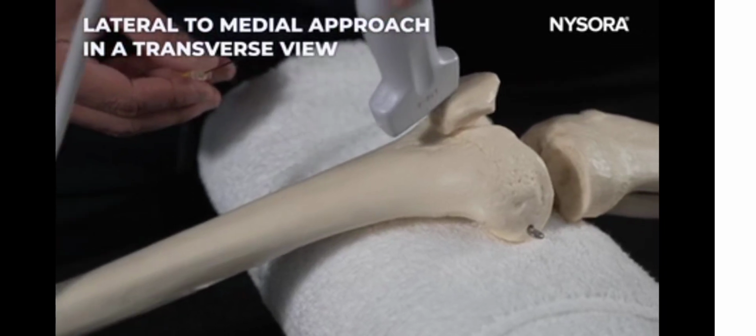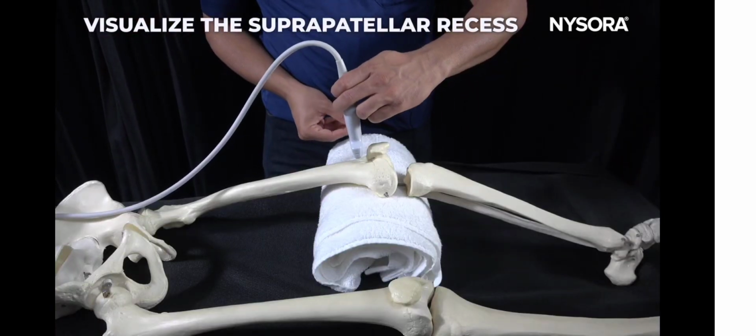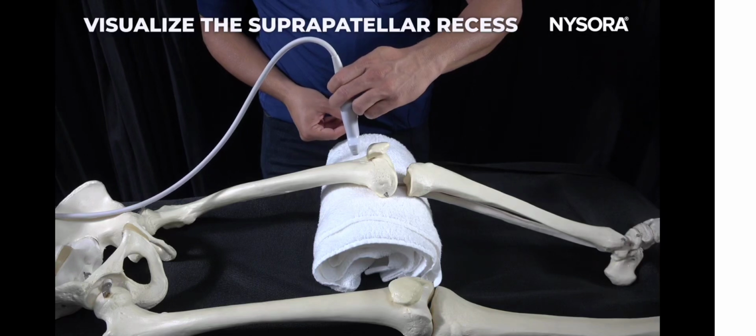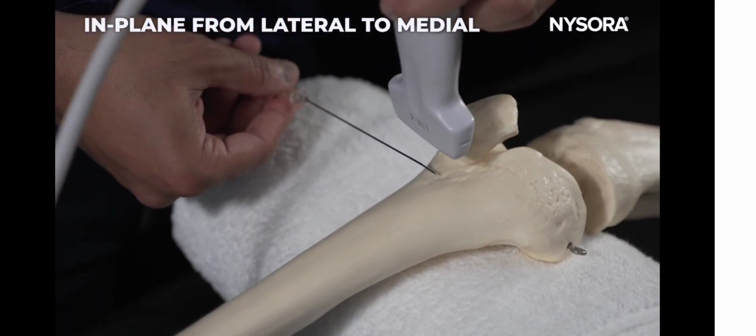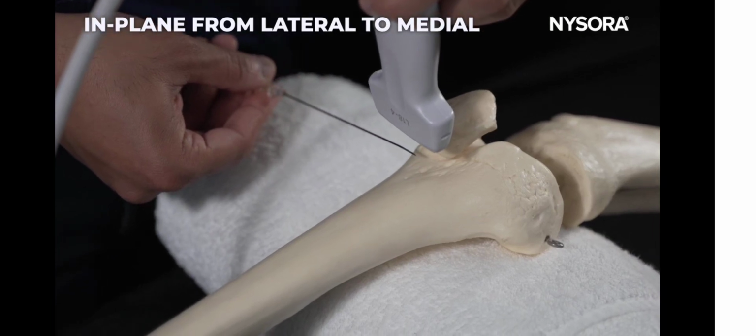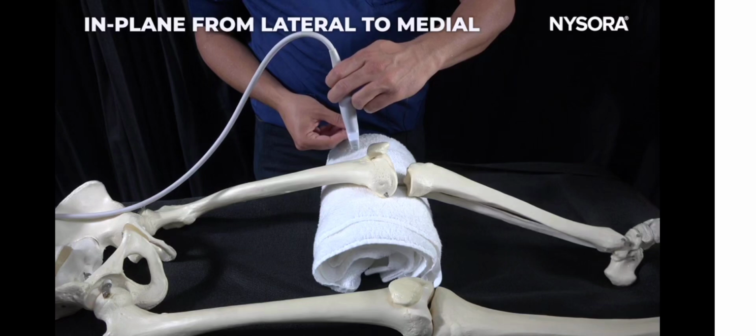Another way to inject the knee joint would be from a lateral to medial approach in a horizontal view. Once you have found the recess, you will turn the ultrasound probe horizontally looking for the suprapatellar recess and bring the needle from lateral to medial in plane technique, injecting the local anesthetic steroid mixture or a hyaluronic acid or a platelet rich plasma injection into the knee joint.